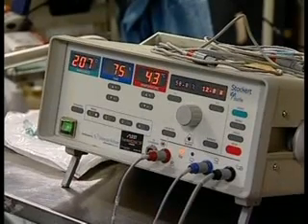Okay. Now you can switch over to fluoro.